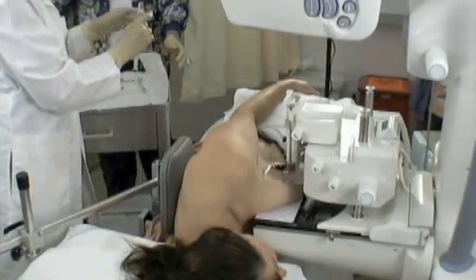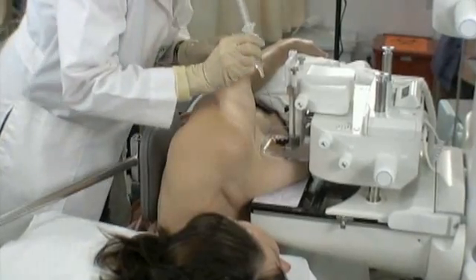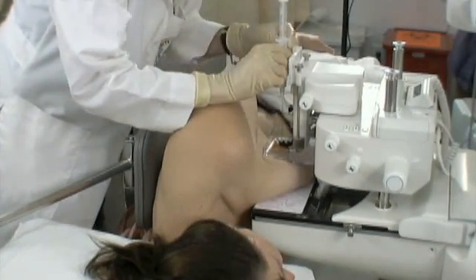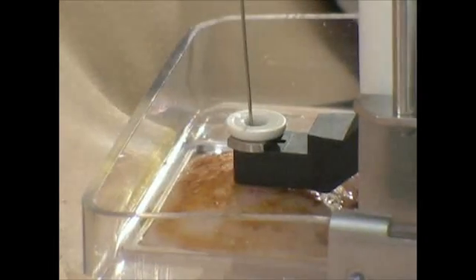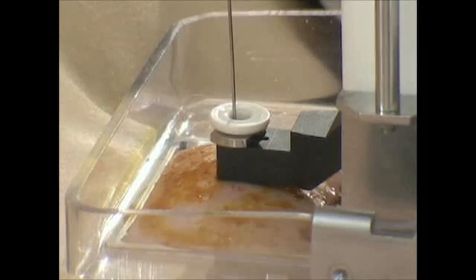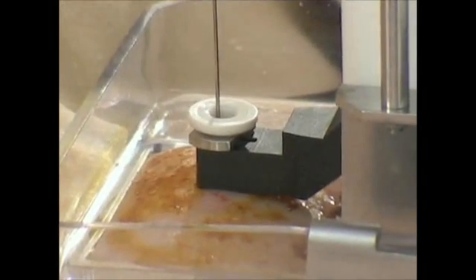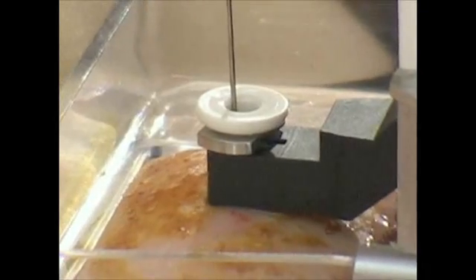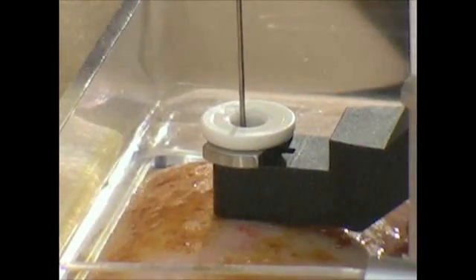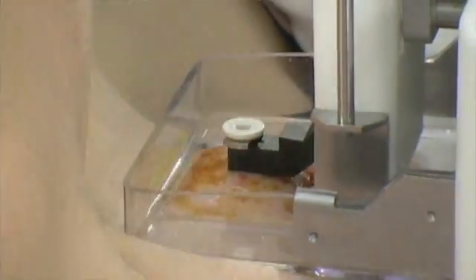The next lidocaine I use is one percent buffered lidocaine with epinephrine. You're going to feel just a little bit of pressure, Karen — going deep. I like to use the epinephrine because it decreases the bleeding at the biopsy site. I typically inject around ten to twelve cc's.